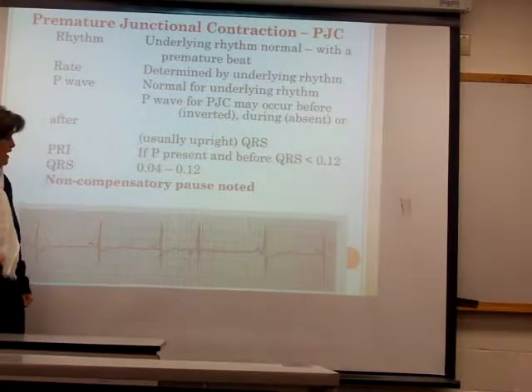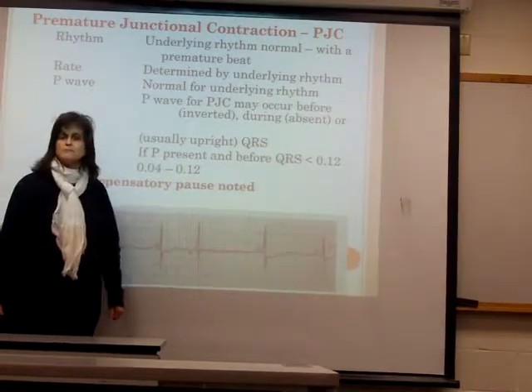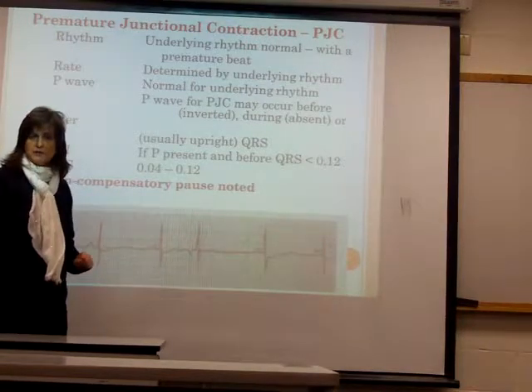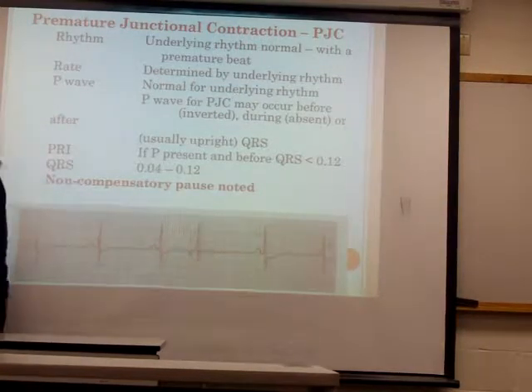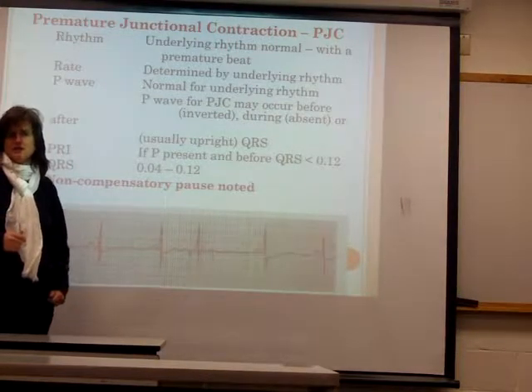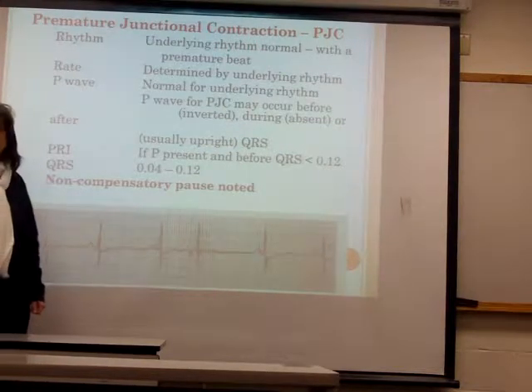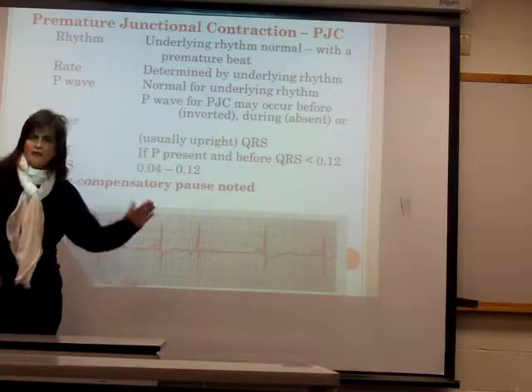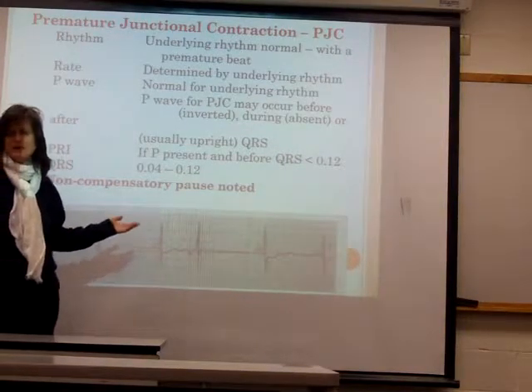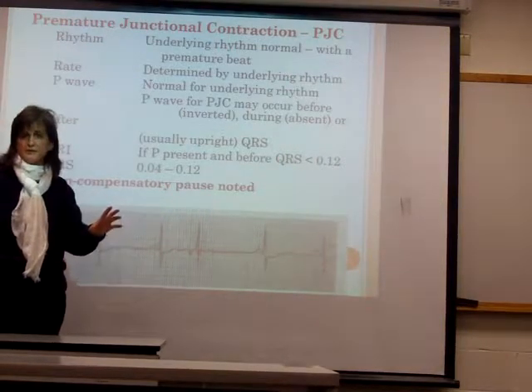Okay? But I also have to address this anomaly. So at the 4th complex, I have a PJC. So the correct diagnosis for this EKG arrhythmia or dysrhythmia is sinus bradycardia with ST segment depression and a PJC at the 4th complex. What's my treatment? Drive it off the heart rate. My heart rate here is somewhere in the high 30s, low 40s. Again, you calculated that. So like a sinus bradycardia, you'd have to treat with or without symptoms.